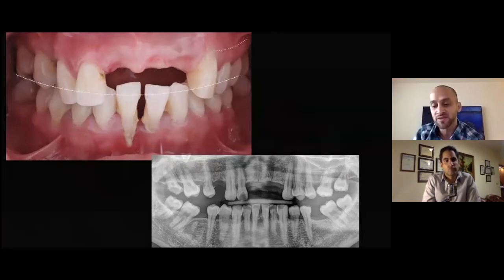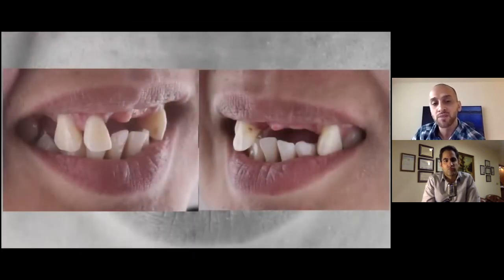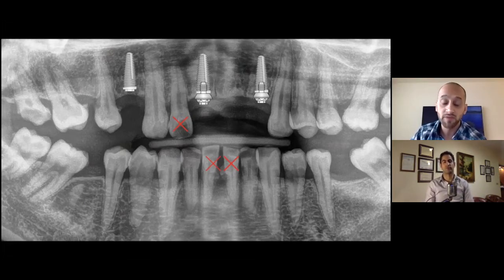So the final treatment plan for this case was extraction of that lateral on the patient's right side, placement of two implants for a 4-unit bridge, and then fixing that mucogingival defect on the lower anterior with a 4-unit ceramic bridge. And a single implant was going to be placed into the top right first premolar.